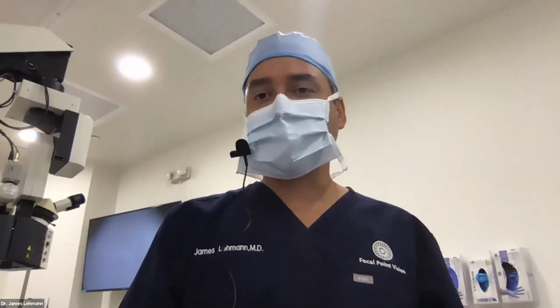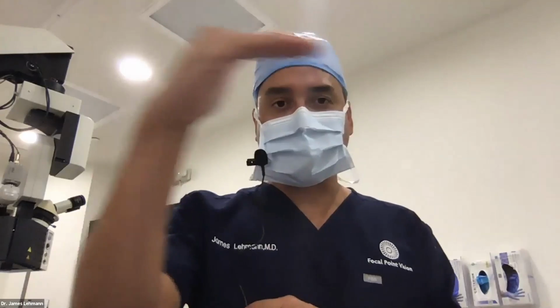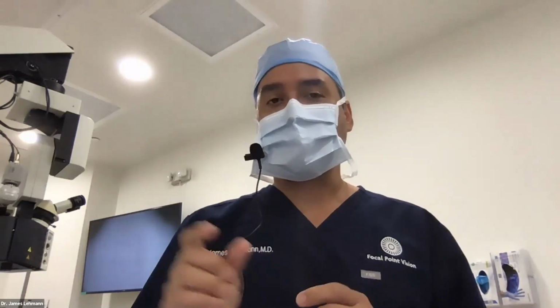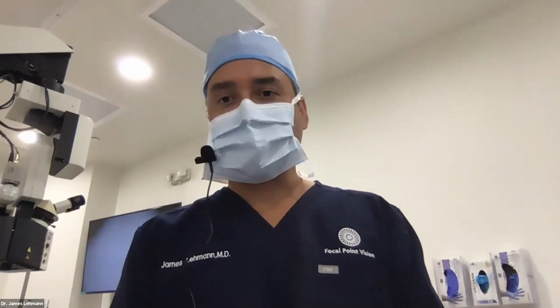What are your recommendations on groove depth? So 80%. When you start to see the striae looking like this, that's when you know you're deep enough with 1.5 phaco tips. Dr. Sherpa says video not working. All right, I think it was working.